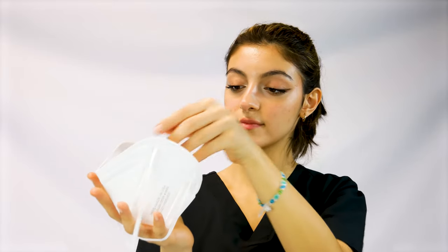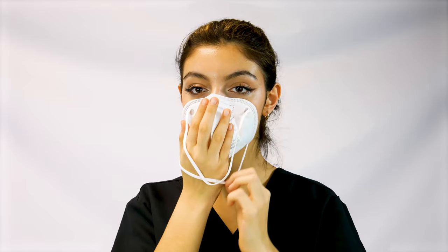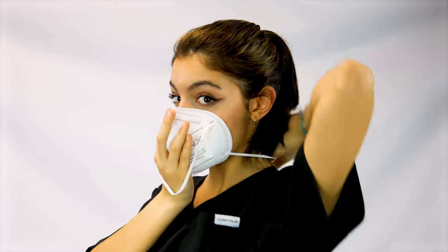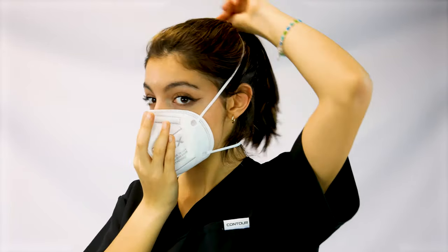Open up the mask slightly. Place the mask on your face, covering your chin and nose. Pull the lower band over your head and release it on your neck. Pull the upper band over your head and release it on the crown of your head.